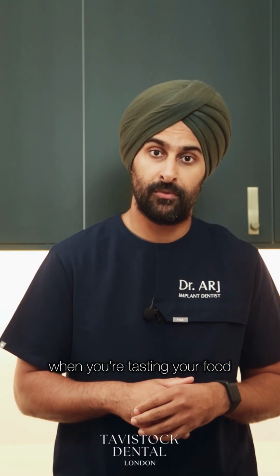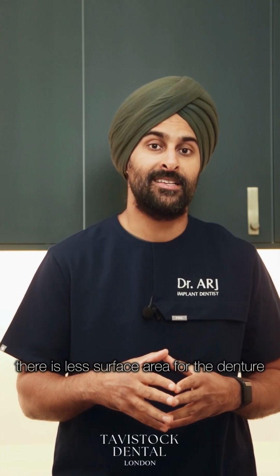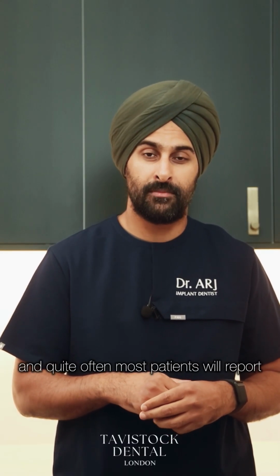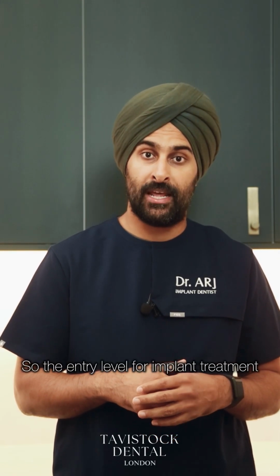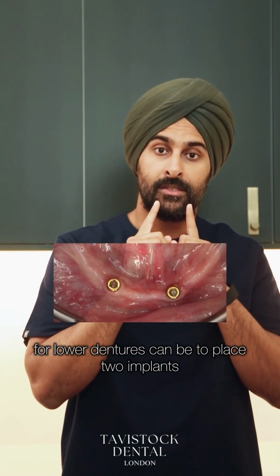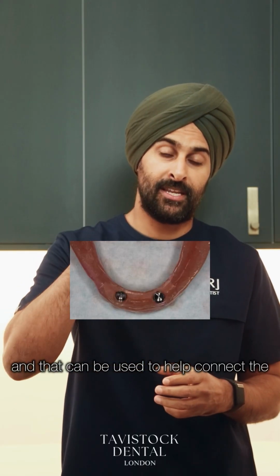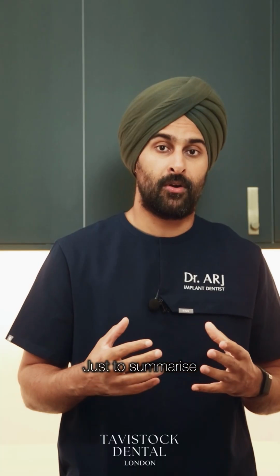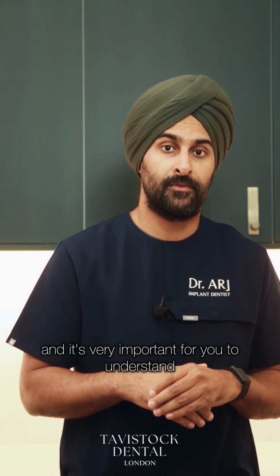because it's quite often on the palate that there are the taste buds that give you the enjoyment for when you're tasting your food. With lower dentures, because there is the tongue in the way, there is less surface area for the denture to sit onto the jawbone, and quite often most patients will report that lower dentures are quite loose. So the entry level for implant treatment for lower dentures can be to place 2 implants towards the front of the lower jaw, and that can be used to help connect a denture onto the top, as you can see in this example.